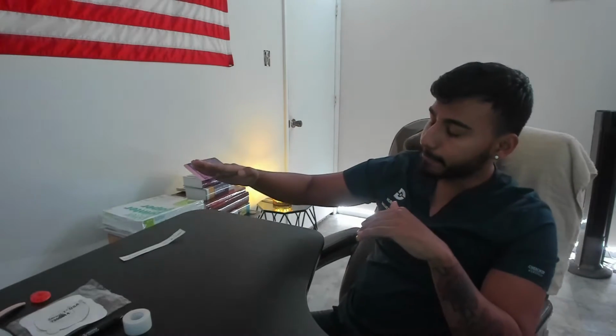Can I have you verify your name and your date of birth? Awesome. And can I look at that wristband? So I look at the wristband and make sure. After I make sure, I can go ahead and put the bed to its working height. I'm going to put the patient in a supine or semi-Fowler position. Lower the rail down to the side that I'm going to be working on.